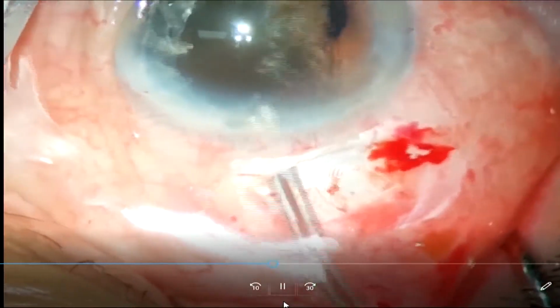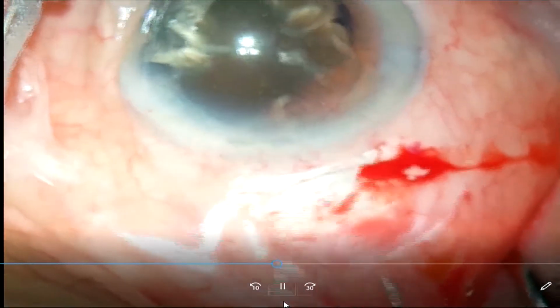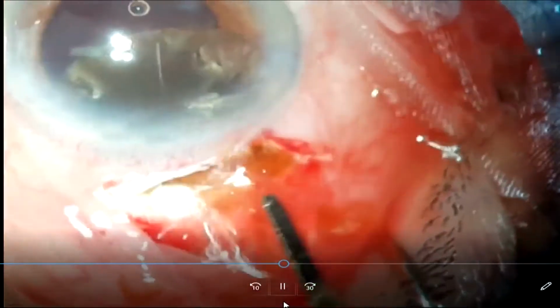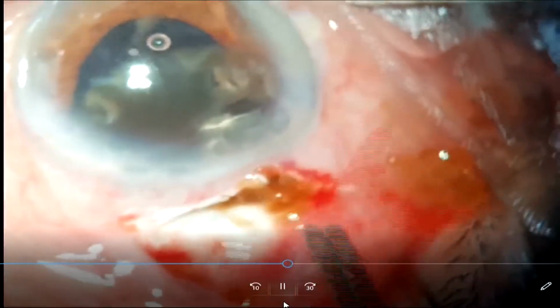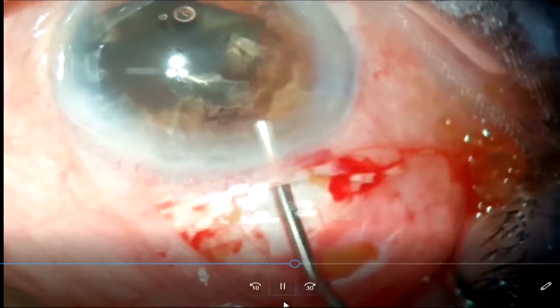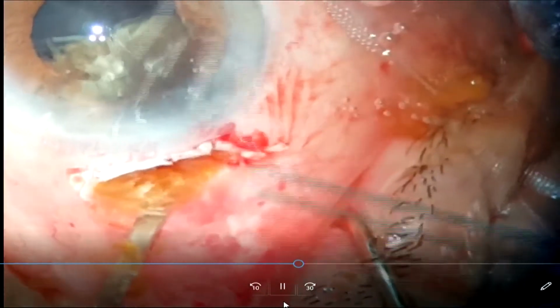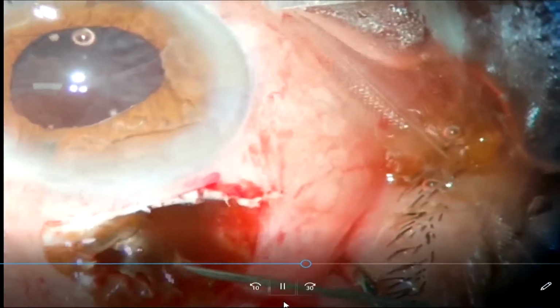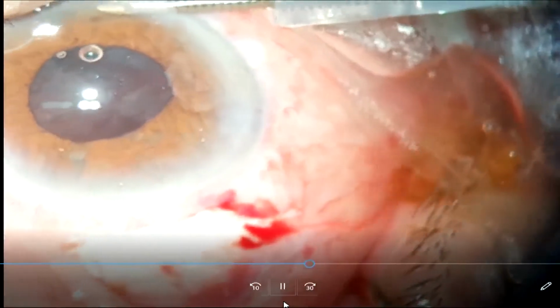Now see, the nucleus has become smaller. I again inject the viscoelastic and re-engage the nucleus. Keep chipping it to bring it out. This may take a little longer time, but it is important that you must make an extra effort to keep on injecting viscoelastic, otherwise your endothelium gets damaged.